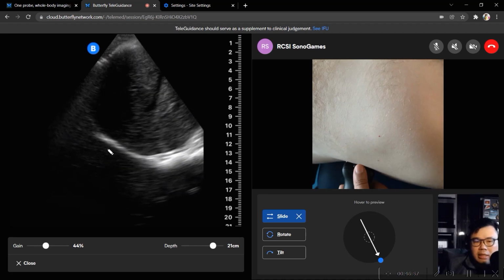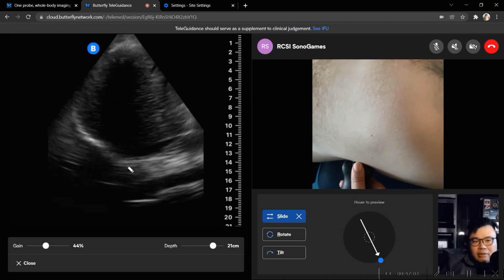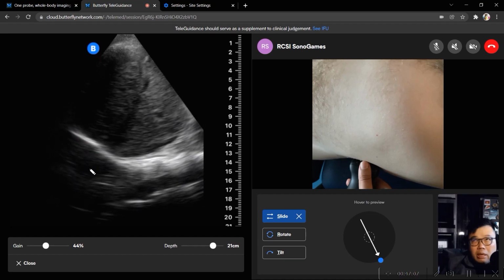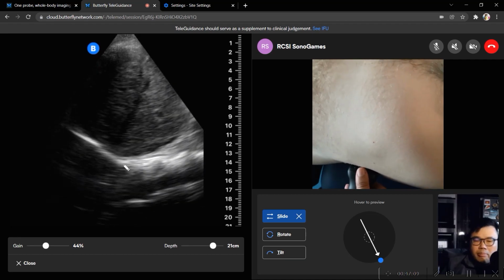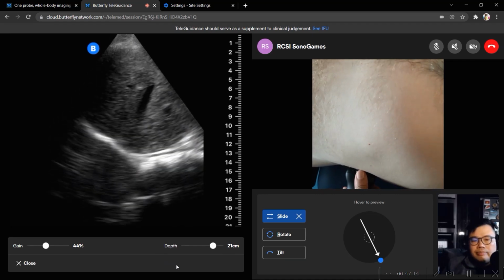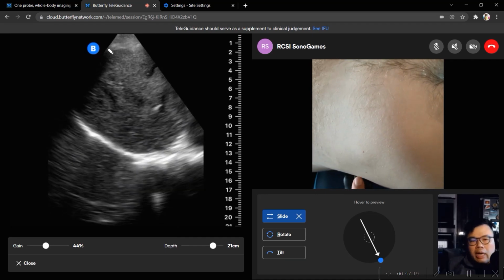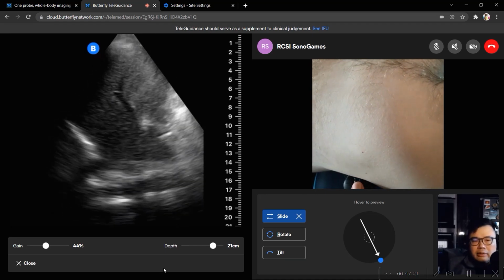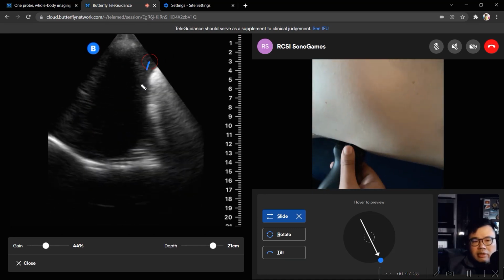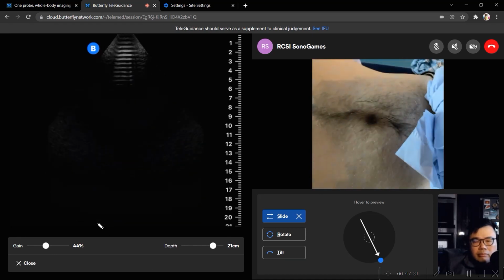Actually, I don't think anybody showed me that before. Thank you. So we're happy there's nothing in the thorax, no pleural effusion or haemothorax. Where do we need to go now? We should see the tip of the liver and make sure there's no fluid there. Along the way down, you can have a look at Morrison's pouch as well. So that's your liver. Do I need more gel? You might, you can see the dropout lines down here.